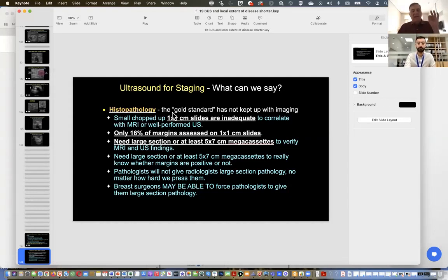So what I'm saying is I would do a follow-up ultrasound in 6 weeks. If they're still enlarged in 6 weeks, then I would core biopsy the most abnormal looking node. Okay, thank you, doctor. But lymph nodes can react to the surgery. With the fairly large seroma, she certainly could have reactive lymph nodes, and perhaps in a few weeks. She's just 2 months from surgery, you said?